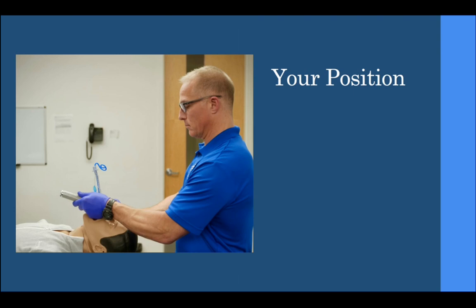So let's start with your position. Ideally, put the patient on a gurney. Unless I'm forced to act or it's a cardiac arrest situation, get the patient on a gurney so you can oxygenate them, resuscitate them, and get yourself in the best position. What you want to do is have the patient's head at about the level of your sternal notch. You want to grip the blade low and basically stand back so you align your eyes with the axis and keep your elbow in tight.